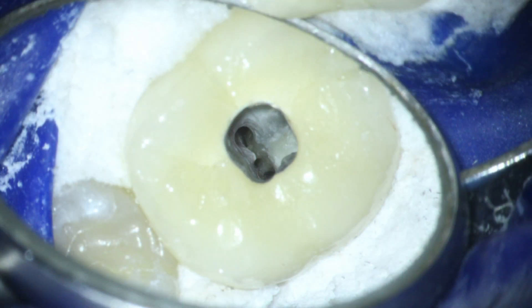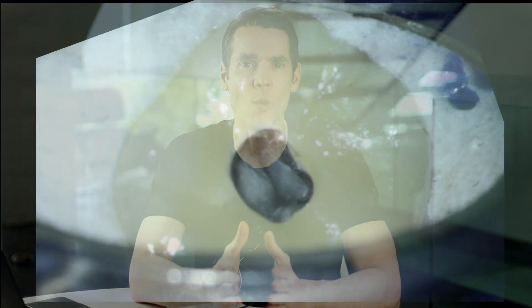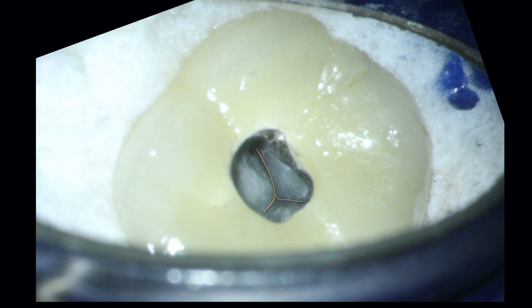I treated three orifices in that mesial root complex, but according to the cone beam scan, we see they all merge into at least one portal of exit. Working our way to the distal, after we find that distal canal, we get some clues on the pulpal floor of where that Radix root is going to be — we call that the pulpal floor roadmap. These are basically developmental grooves that lead us in the direction of where the canal orifices are.